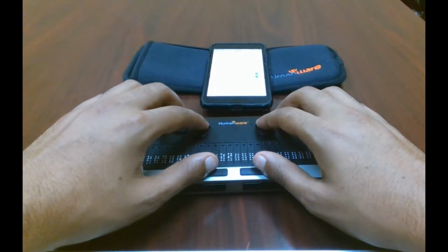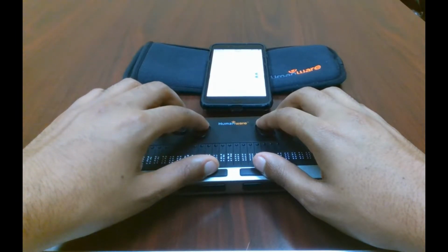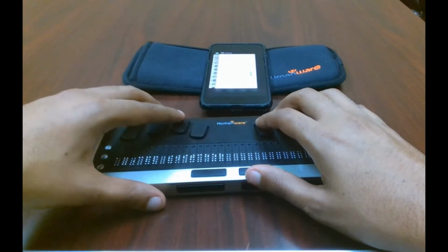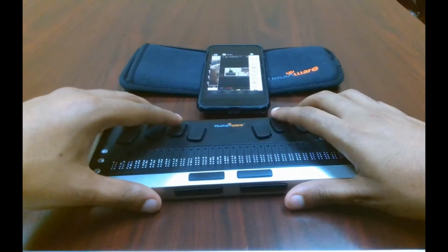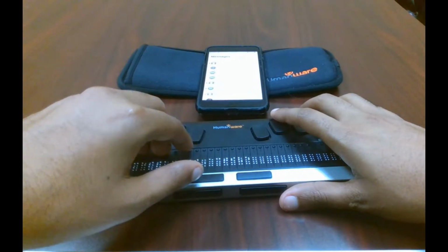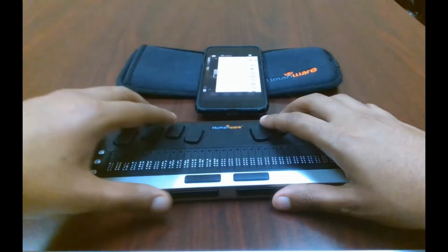Another useful keystroke is the HH chord, and by that I mean you hold down the space bar and press H twice quickly, which will bring you to the app switcher, to where you can go through the different areas.